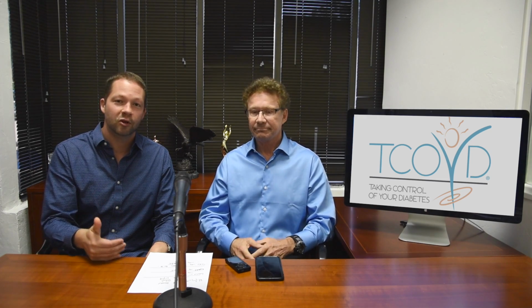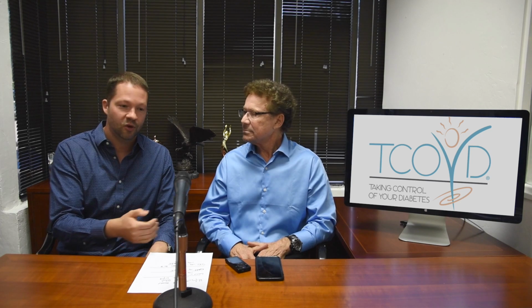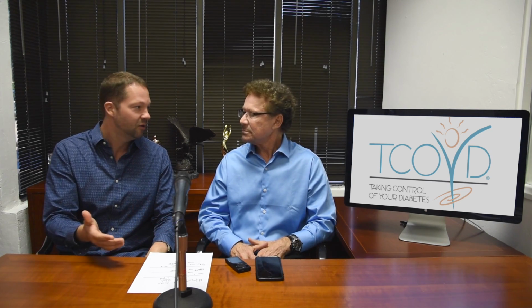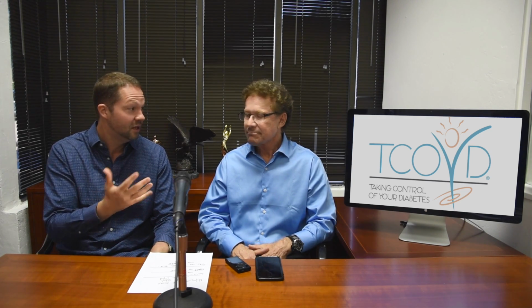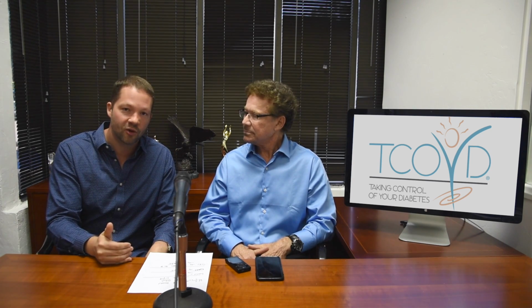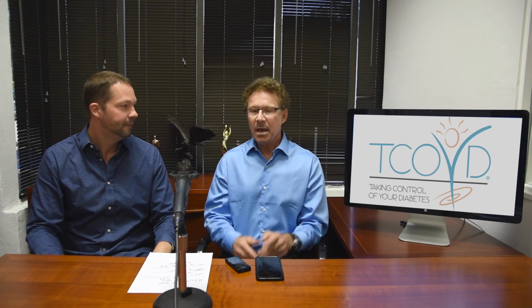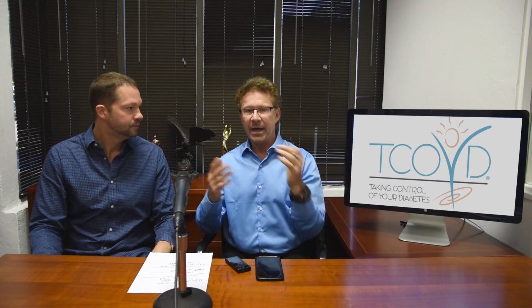Repeat low, I'm a little bit more aggressive with because I want to know sooner if I'm low. Sometimes I look at people's downloads and they're 60 all night long. That's a dangerous situation. Super dangerous. So I have my repeat low set at 30 minutes. If I haven't woken up or corrected my low, I want to know about it. Yeah, at least if you look at it, you see a trend going like that, you can say, okay, I'm coming up.